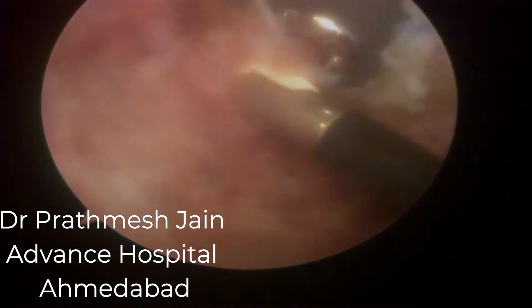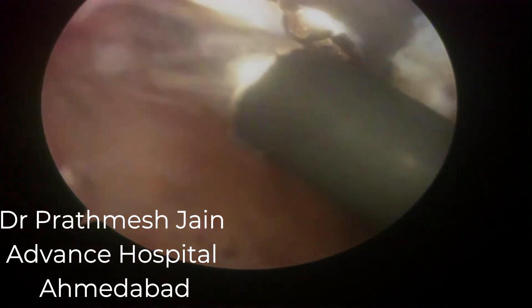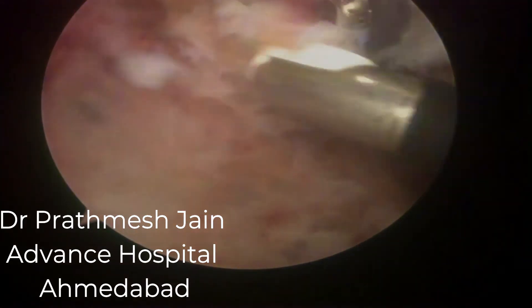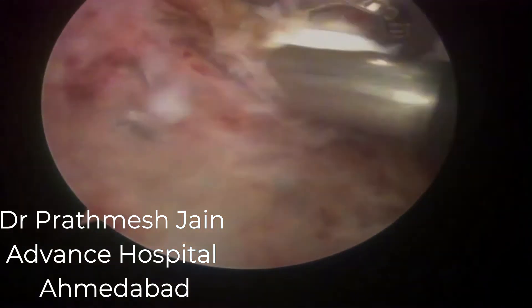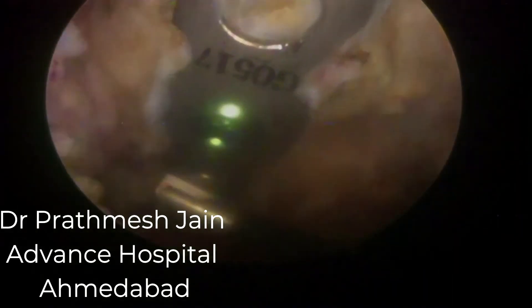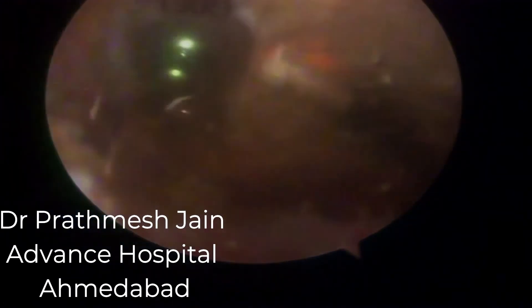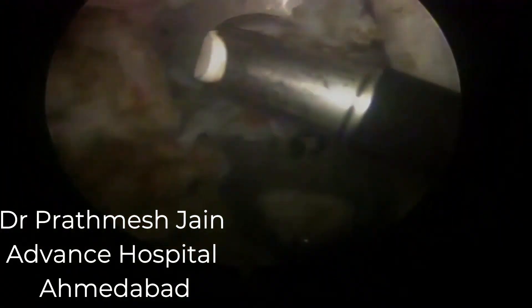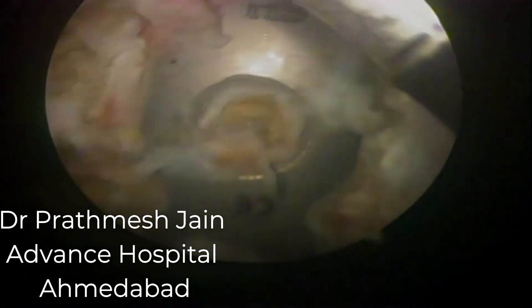One more thing to remember in these cases: be very careful with your scope. There are reports of scopes being damaged because of tight adhesions. Avoid forceful manipulation of the scope — be very gentle. Whenever releasing this type of tissue, always use the radiofrequency probe as a lot of bleeding may occur. I always use a suction drain in these patients, kept for two days, because this is a bleeding procedure.